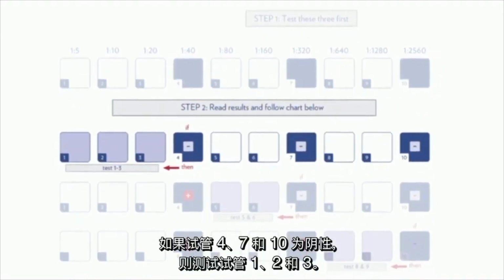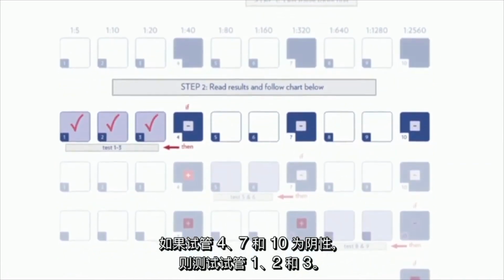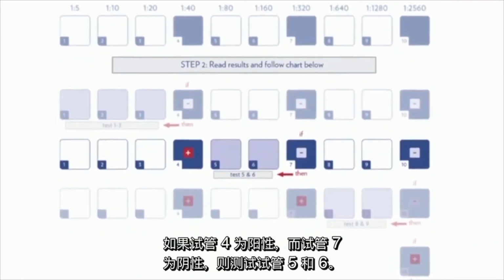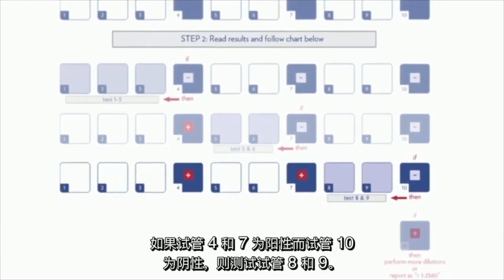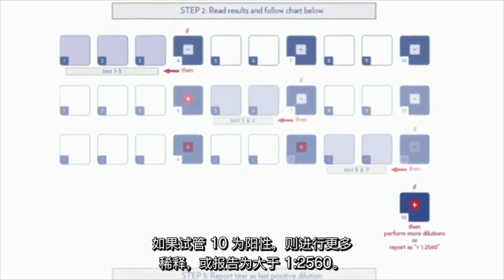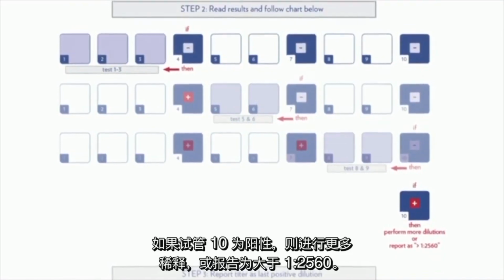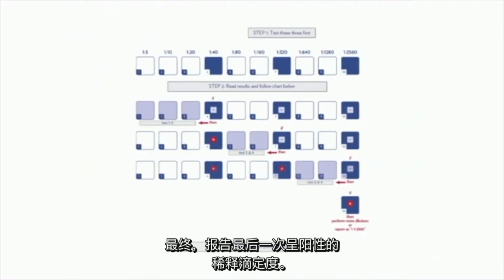If tubes 4, 7, and 10 are negative, test tubes 1, 2, and 3. If tube 4 is positive and tube 7 is negative, test tubes 5 and 6. If tubes 4 and 7 are positive and tube 10 is negative, test tubes 8 and 9. If tube 10 is positive, perform more dilutions or report as greater than 1 to 2560. Conclude by reporting the titer as the last positive dilution.